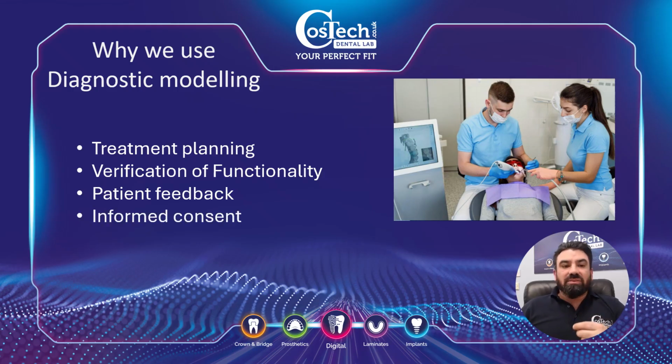It helps massively with informed consent, because the worst thing that can happen is, as you know, when you go through the full treatment plan and at the end of it the patient isn't happy. This is a way that we can actually say, look, this is what you're going to have at the end of the case. And if they say anything, we'll be like, look, this is what we agreed on before.